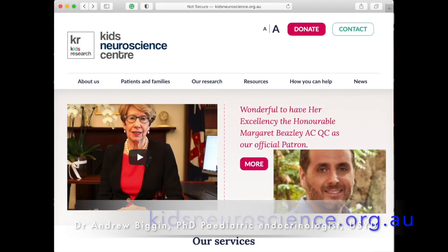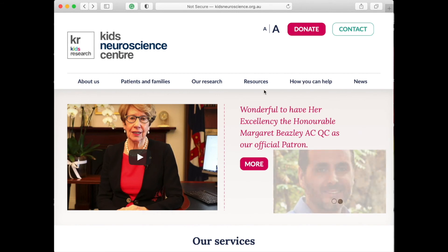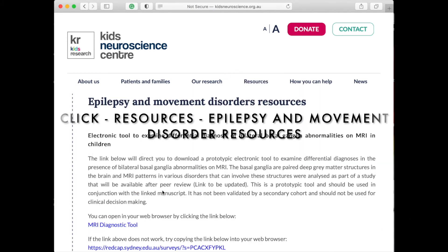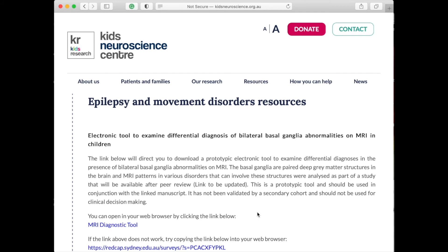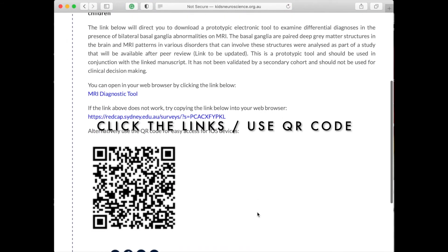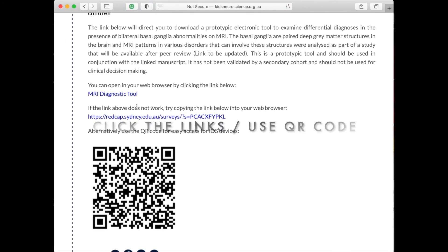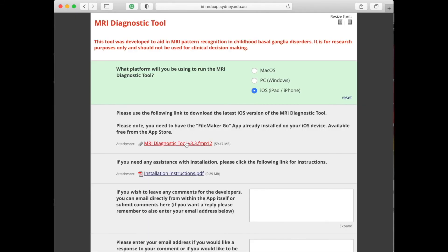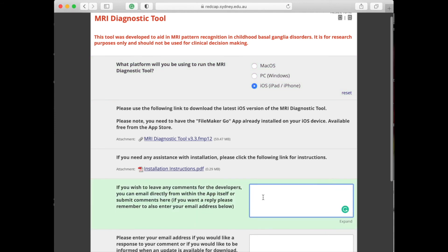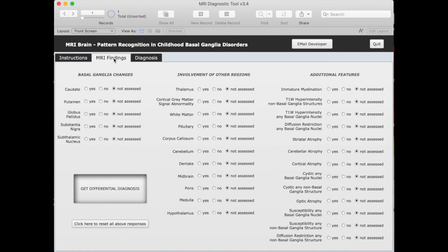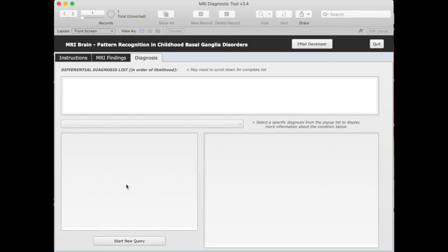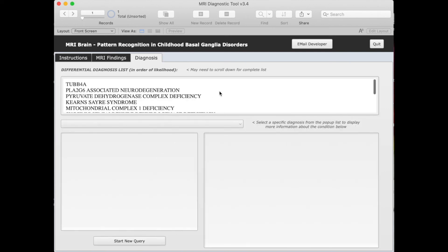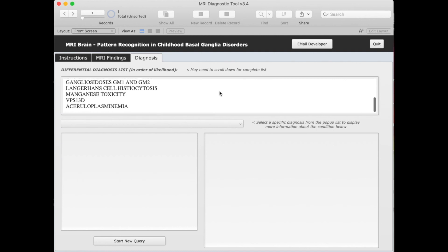To download the app, you can go to kidsneuroscience.org.au. From here, you can download the actual file as well as leave any comments and feedback. To get started, hit MRI findings, and then click the present or absent features of your particular MRI scans. You can click the Get Differential Diagnosis button to obtain a list in order of all the likely diagnoses that meet your criteria.